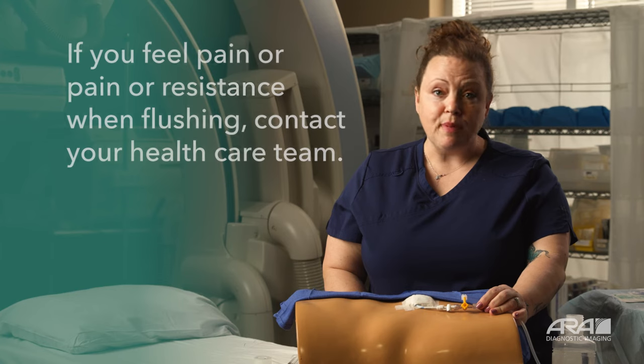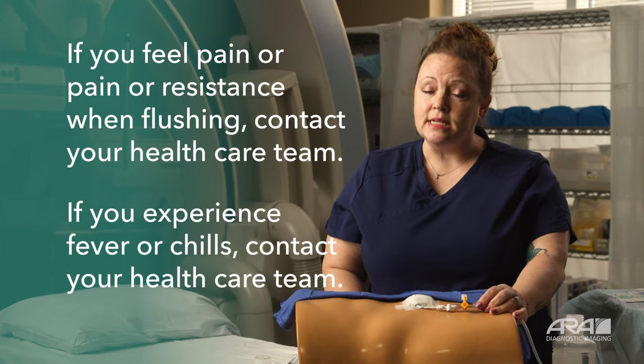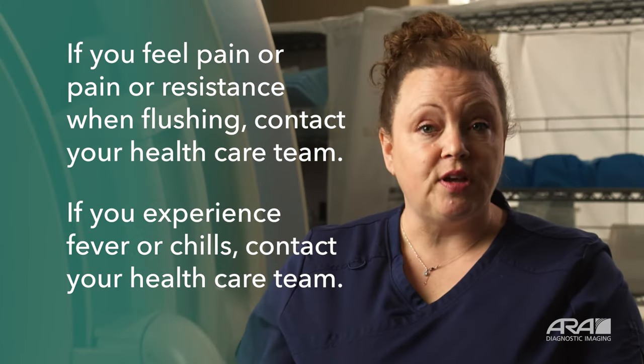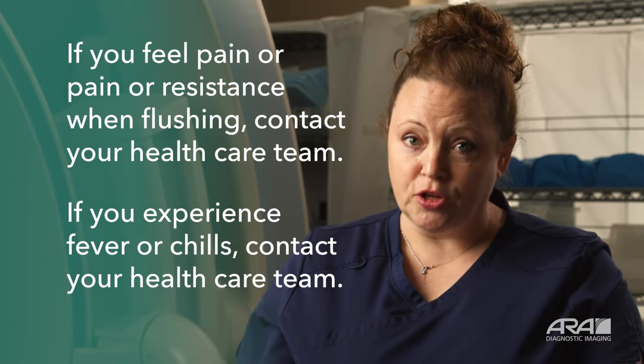If you feel any pain or resistance when flushing your drain, please contact your doctor immediately. Should you experience fever or chills after flushing your drain, call your doctor.